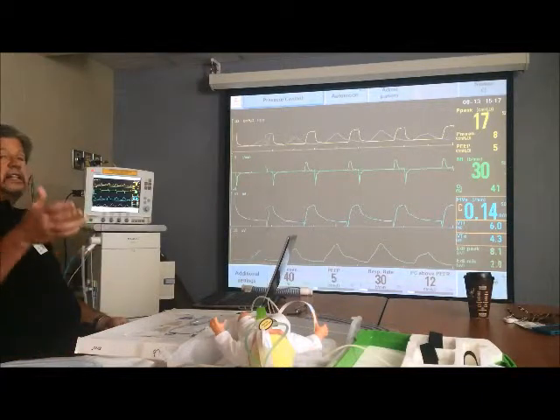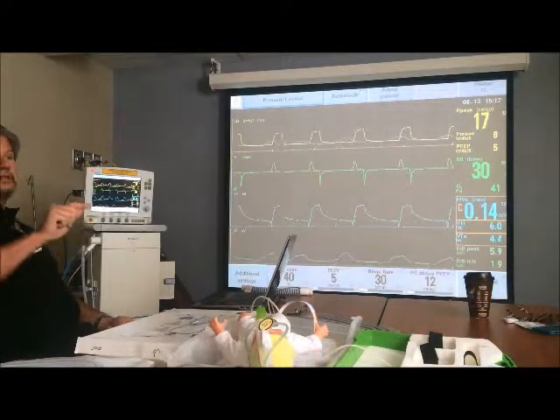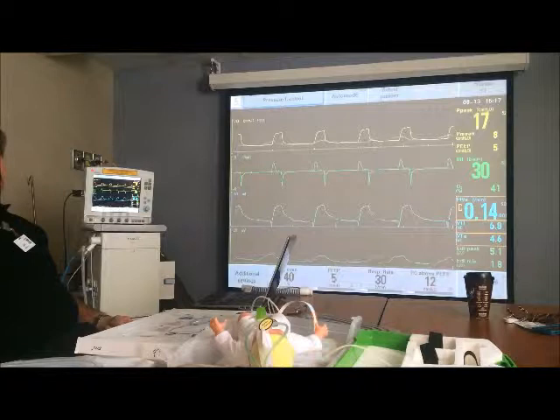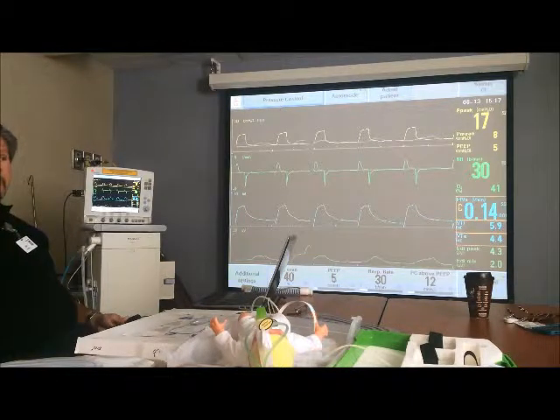I said, the reason he appears as though he's breathing is because there's a leak somewhere, and the ventilator is autocycling. When they sealed the leak, after a few seconds, here comes the EDI. Because he wasn't being ventilated anymore, the brain went, oh, I better start telling the diaphragm to move, and so the diaphragm started to move.